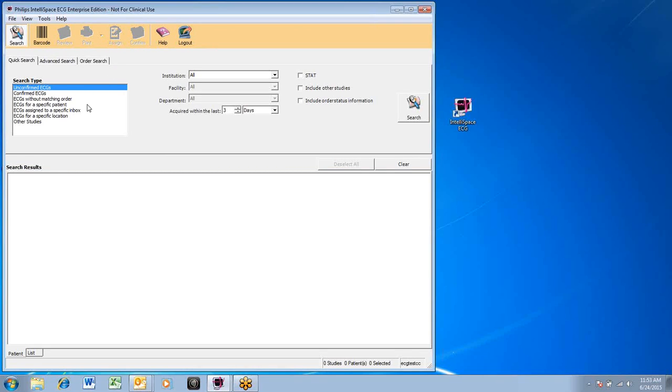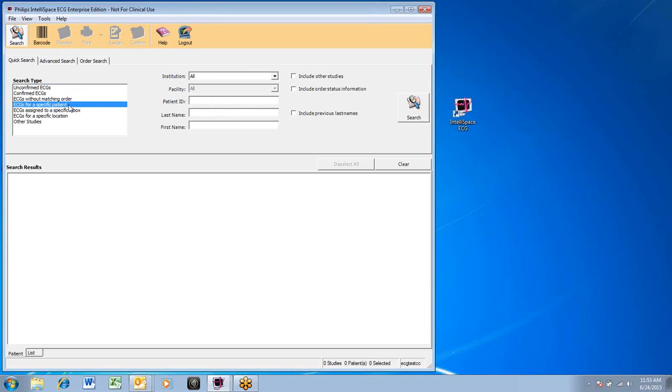The most useful and efficient type of search is ECG for a specific patient. A new area will open up for data entry so that you can narrow down the search.